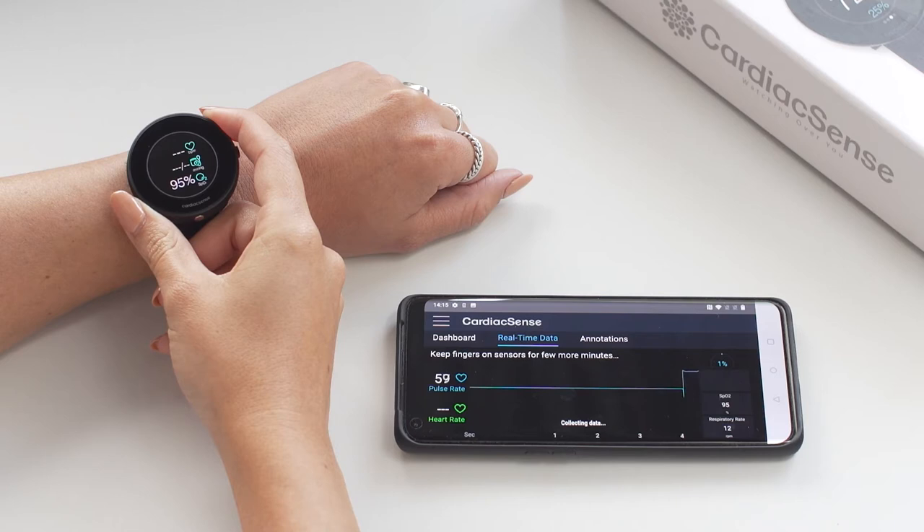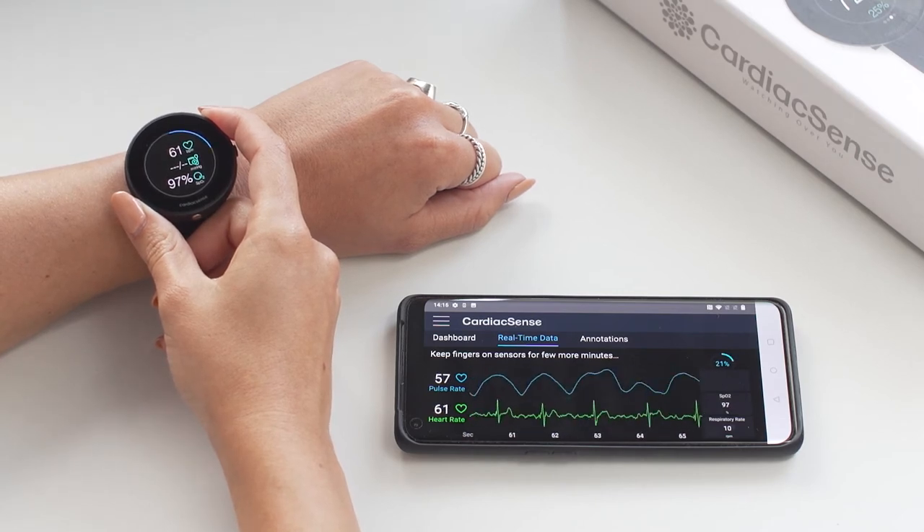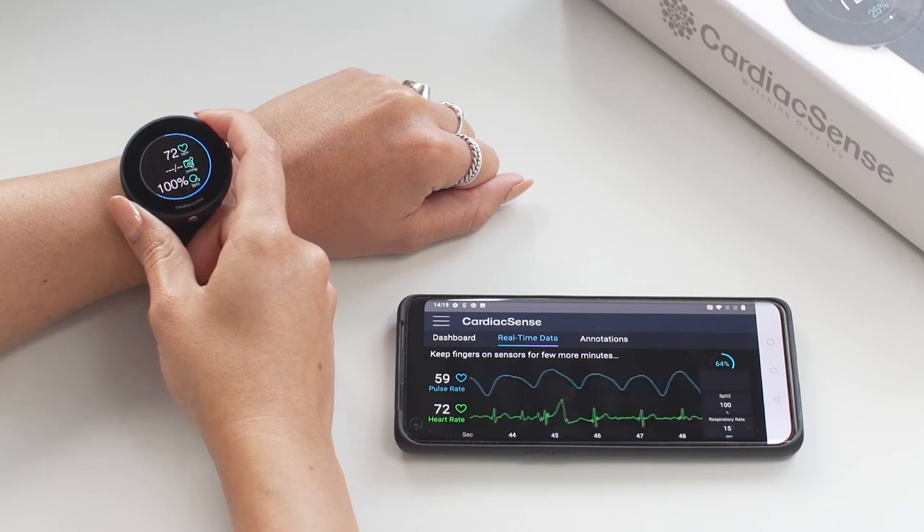Measurement starts after a couple of seconds and may take a few minutes. Please be patient and do not remove your fingers until the process is complete. You can see on your watch the blue circle advancing until completion.